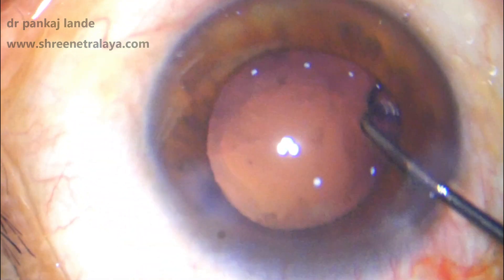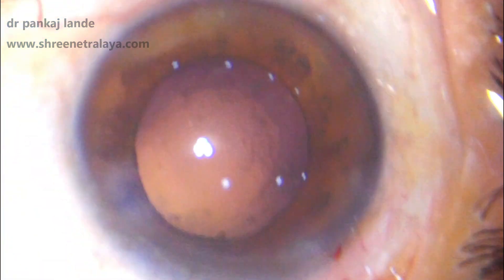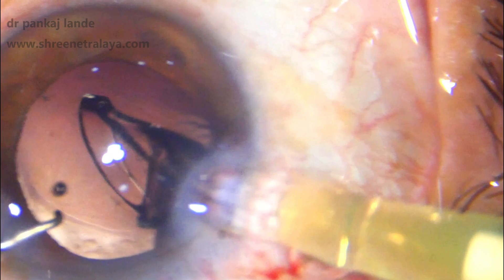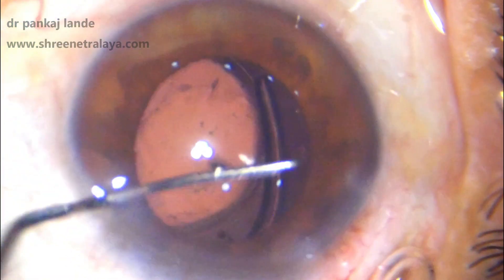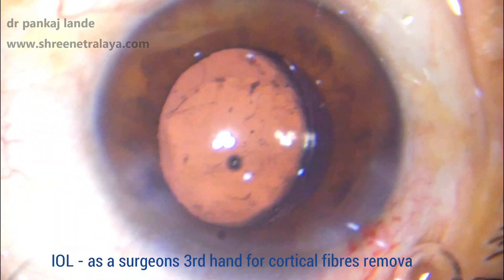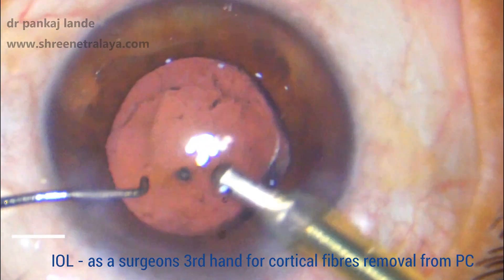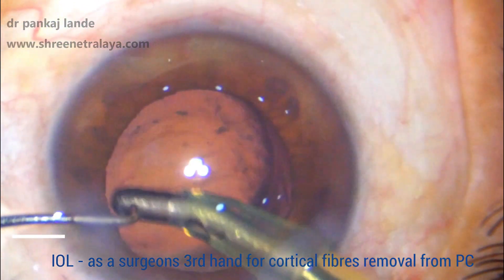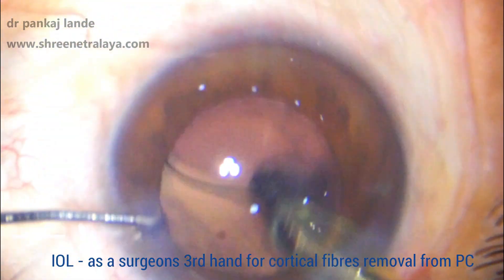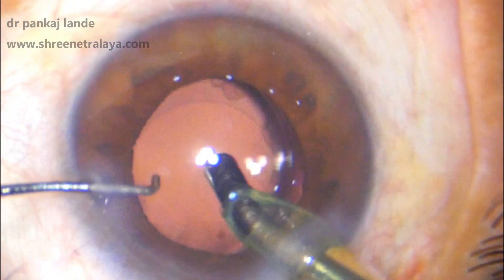Now, how to get rid of these residual cortical fibers — going with the IA probe and removing this is not easy. One can catch the posterior capsule while removing it and have a PCR at the end of surgery. To avoid this, what I do is implant my IOL and use the IOL as a surgeon's third hand. I take the IOL and sweep it from side to side so that the cortical fibers get detached from the posterior capsule, and then go behind the IOL to remove these cortical fibers.